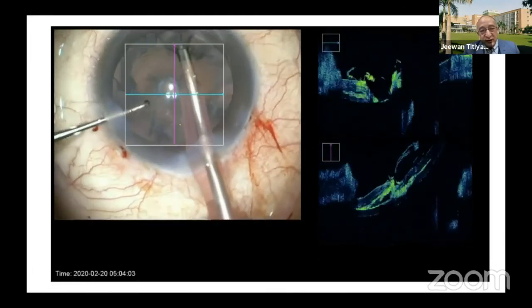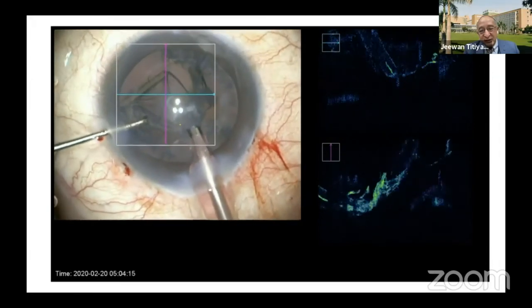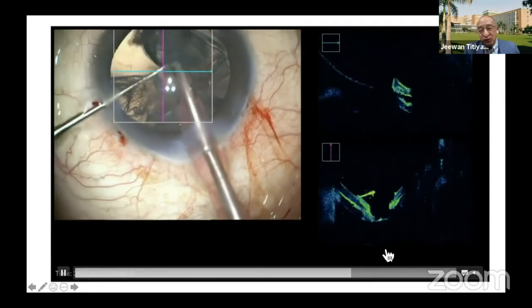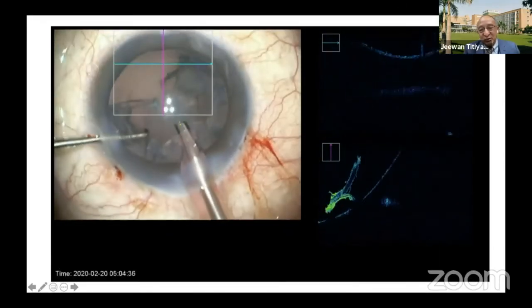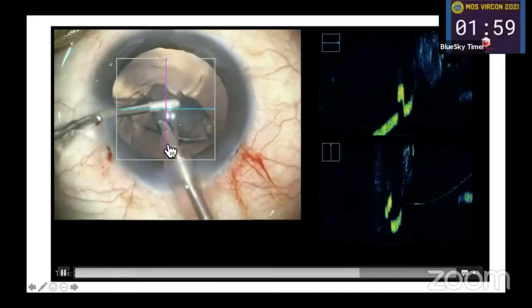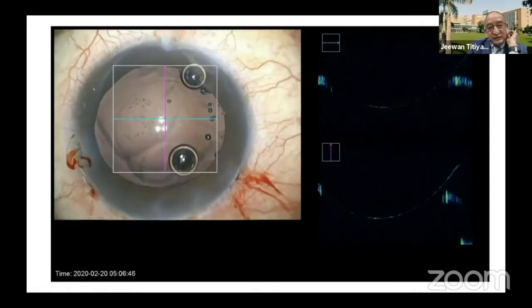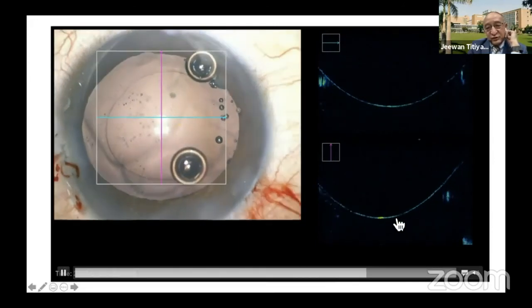You can see here that now I'm trying to take out the epicortical cushion layer by layer. At this time also, this is a cushion I can see, and I can see the posterior capsule also. So this also gives you relief that you are not playing with the posterior capsule. You have an intact posterior capsule there. And subsequently, you can see I'm trying to take out the epicortex in bulk, and that saves the posterior capsule in difficult case scenarios. You can see a clear intact posterior capsule on IOCT.